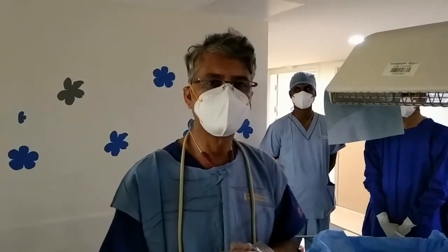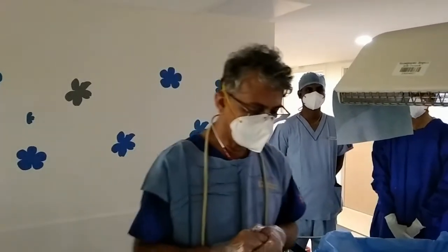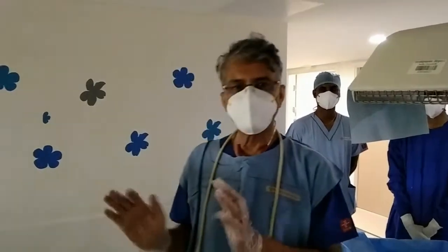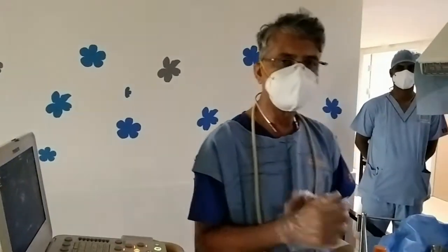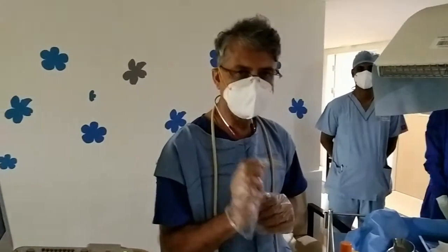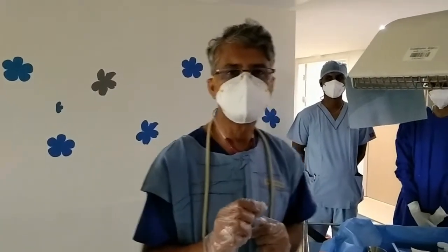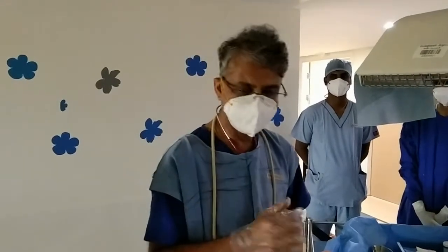I am Dr. Venkatesh, I am a consultant neurologist. Today I am discussing the utility of bedside ultrasound in the determination of the needle length that actually travels into the cerebrospinal fluid space.